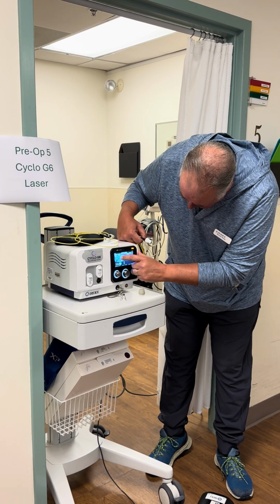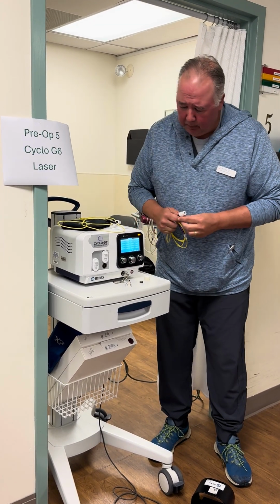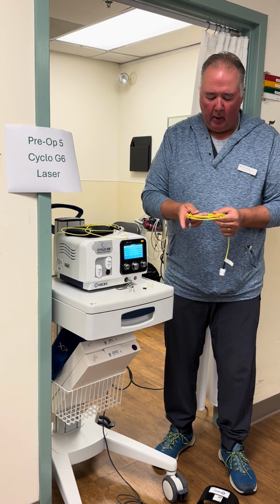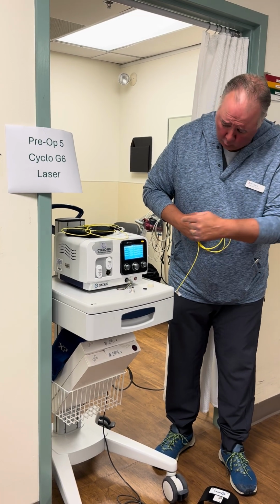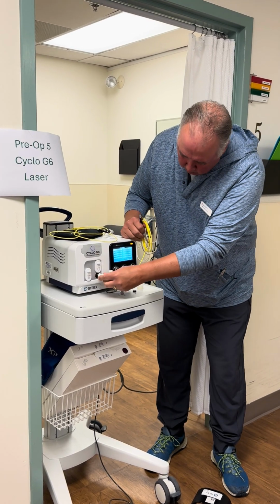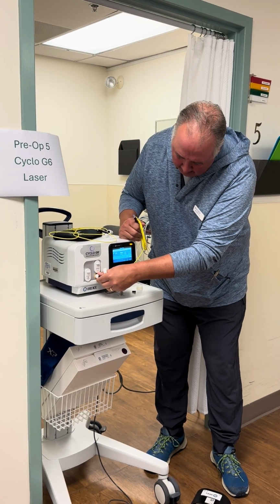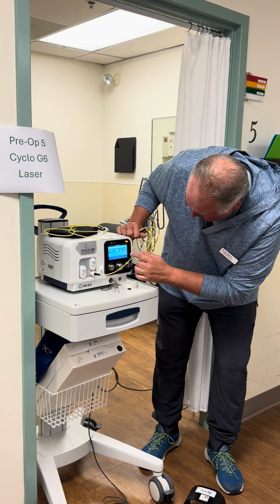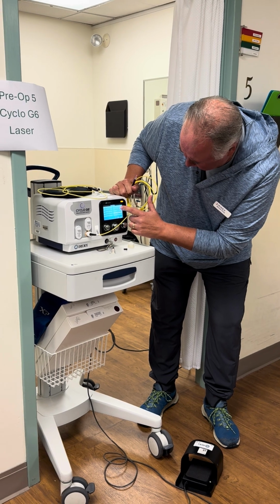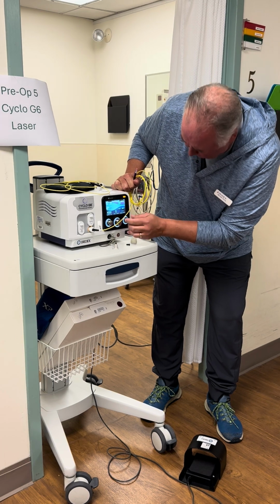I'm going to go back to presets. Now for the G probe, there's two different settings here. One for a dark iris, a darker eye, brown eyes, whatnot, and there's one for lighter eyes, so somebody that has like bluish or hazel eyes. It just treats the pigment in the eye a little bit differently, a little more or less aggressive. So I'm going to go for the dark eye, because most people are dark eyed. We're going to hit select. Micropulse off.